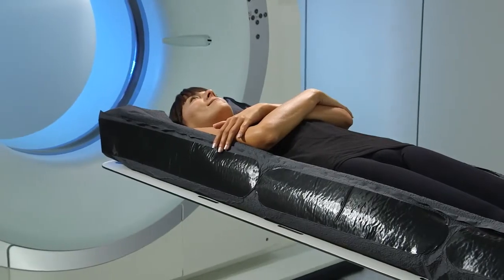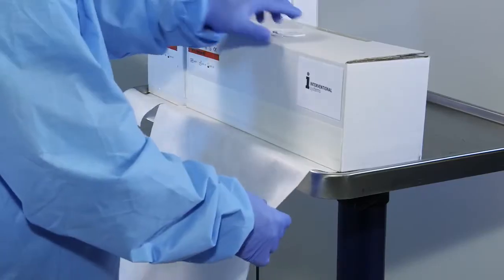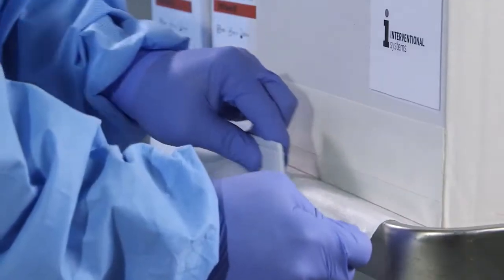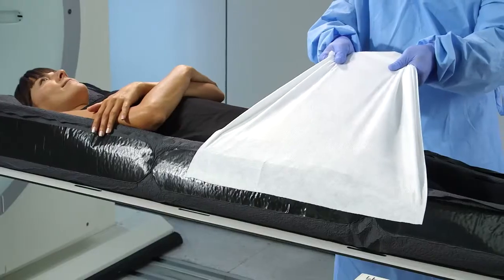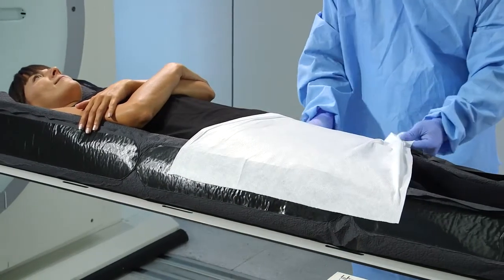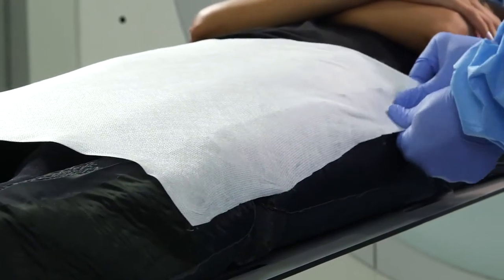By following these simple steps, the patient is stabilized in seconds. First, estimate the required length of iFix fleece and cut. Next, attach the fleece to the anchor product, then pull the fleece tightly up and over the patient. Finally, adhere the fleece to the anchor product on the other side of the table.